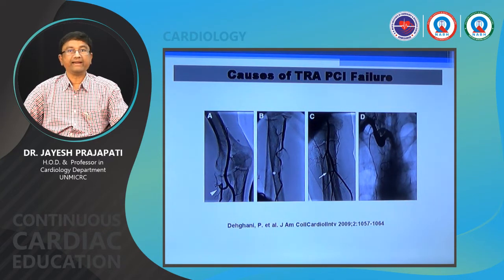Tell the patient to take a deep breath, and then usually your Terumo wire falls into the ascending aorta because of the mediastinum, everything goes, the thorax goes down. So a deep breath is one useful aid. Sometimes rotation can help, to maneuver a catheter like the JL or the Terumo catheter. The Tiger catheter can help.